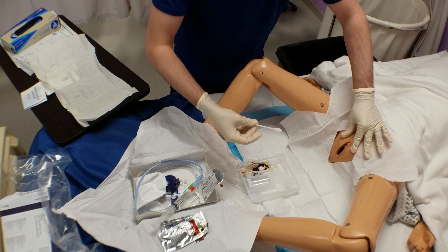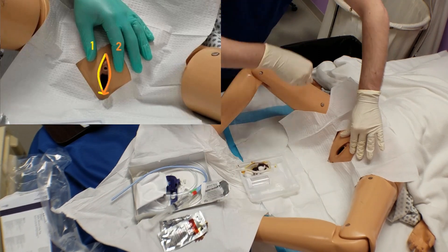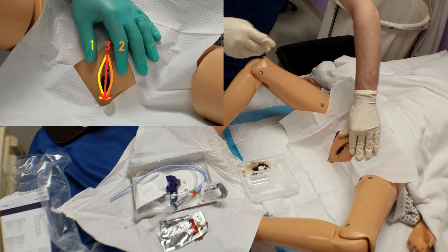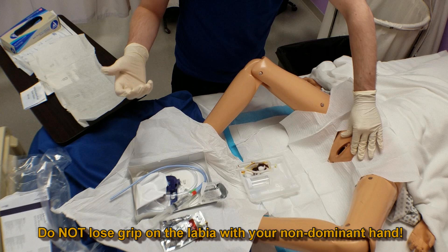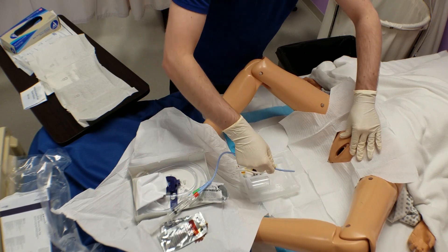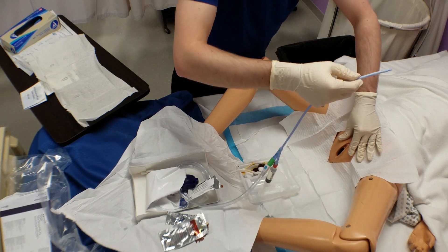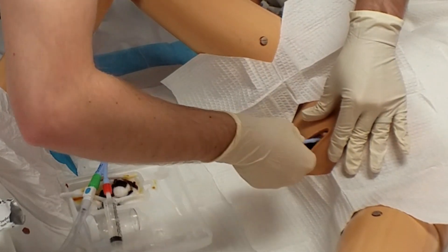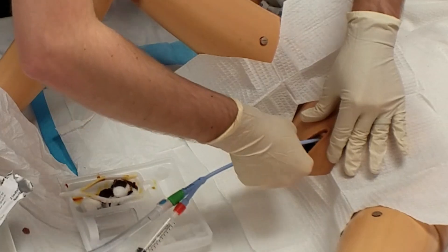Using three total swab sticks, wipe from top to bottom on the labia. The first swipe should cover one side of the labia, the second stick should wipe the opposite side, and the third stick should work down the center covering the urethra and the exterior portion of the vagina. Do not lose grip of the labia with your non-dominant hand, as this would contaminate your prep and require you to re-prep the perineum. You should now pick up the catheter and prepare to insert. Ask the patient to bear down gently as if voiding. Be aware of the entirety of your catheter — do not let it become contaminated by touching the edges of the drapes, the patient's legs, or yourself. If the catheter touches any non-sterile area including your non-dominant hand, stop, remove the catheter, and prepare to start over with a new catheter.